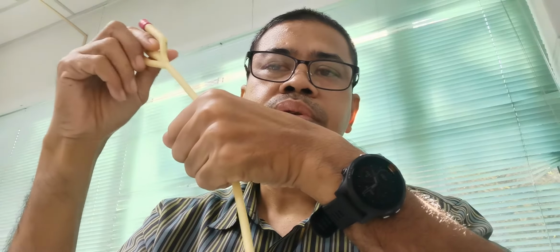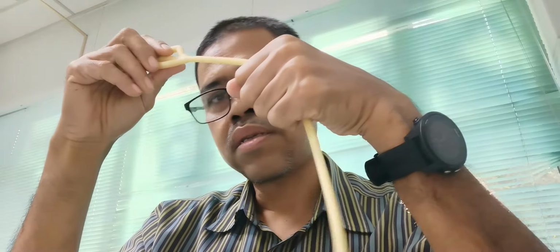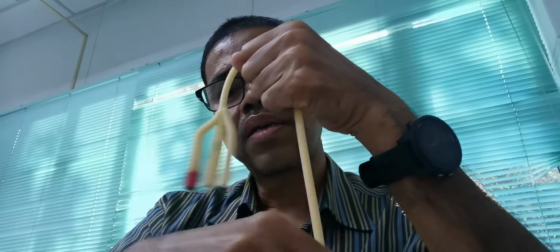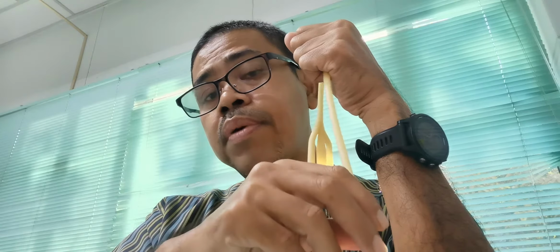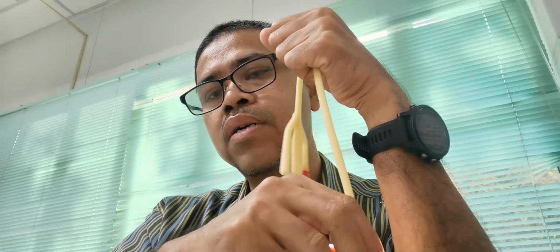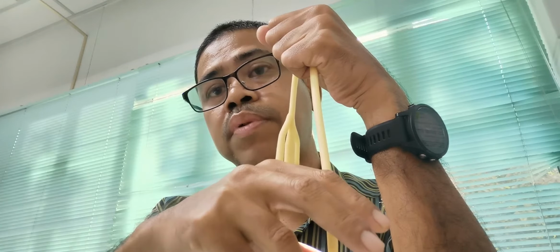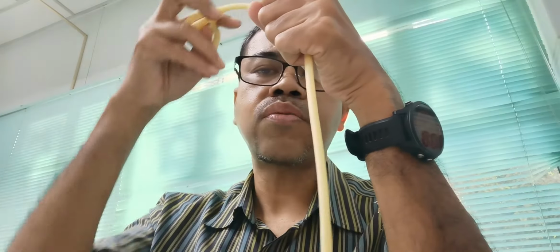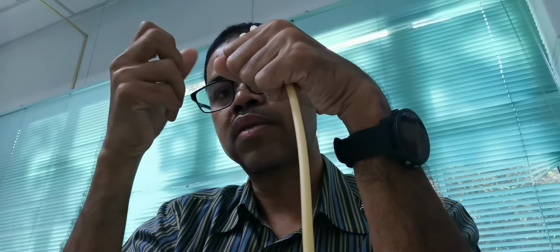If you inflate the balloon at this stage, the tip of the catheter is still in the penile urethra. It's not in the bladder. So as a result, it can cause distension injury to the penile urethra, right? So you have to push it all the way so that the tip will bypass the prostate, go through the prostate and then be inside the bladder, so you can safely inflate the water for injection.